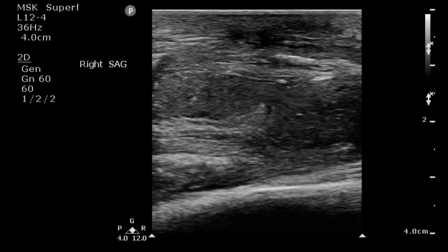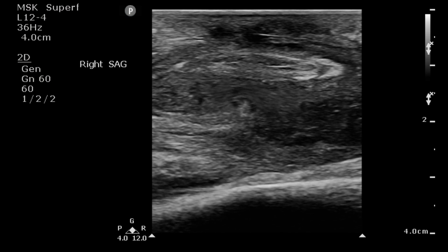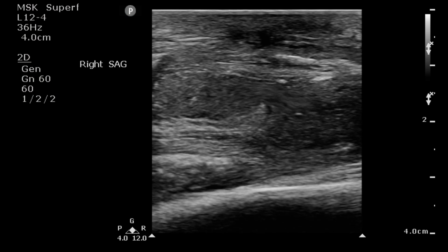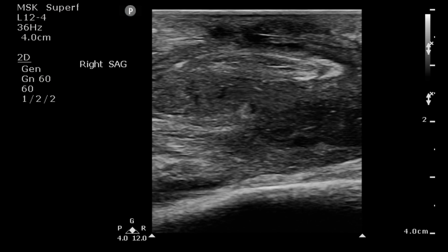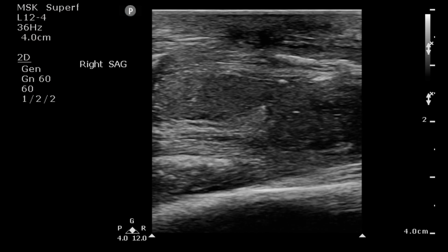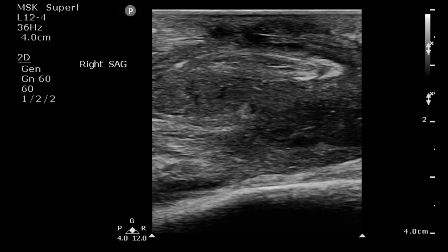And I have an article to point to published by Jen Marin where they basically broke things down into obviously cellulitis, obviously abscess, and we don't really know, right? Those 3 different cohorts. And ultrasound really had the most profound effect in the we don't really know category and really didn't change management much on the obviously-we-know sides of the aisle, right? And I think that's an argument to be made, for those who desire to maximize their efficiency. You can make that argument.